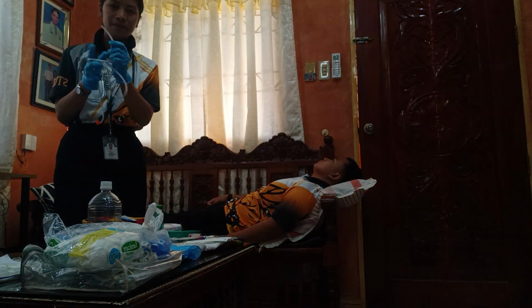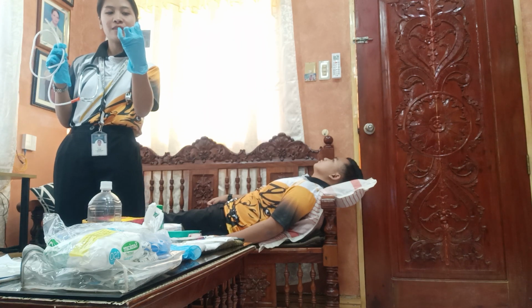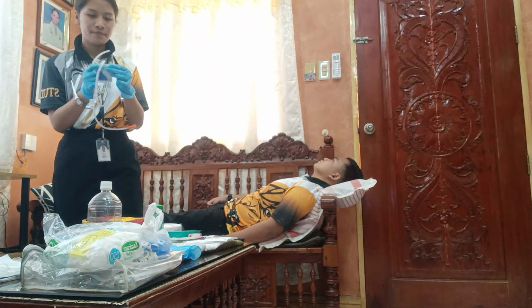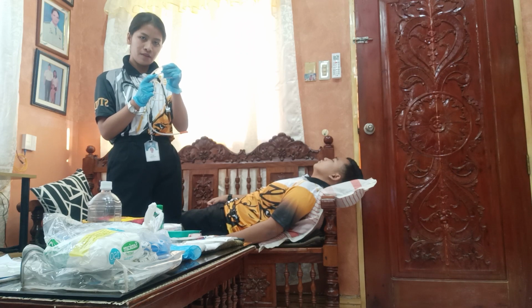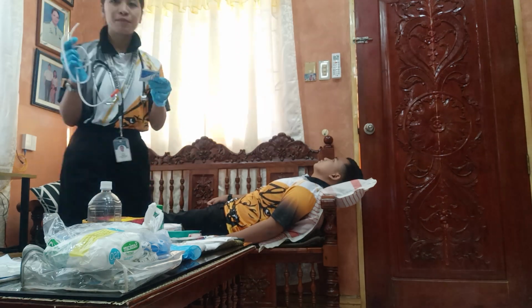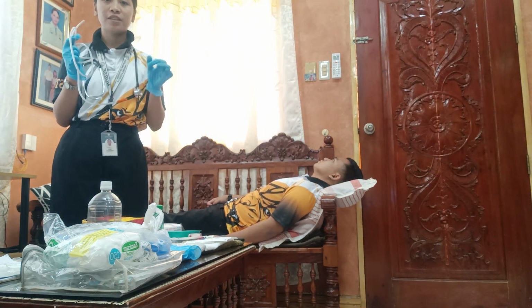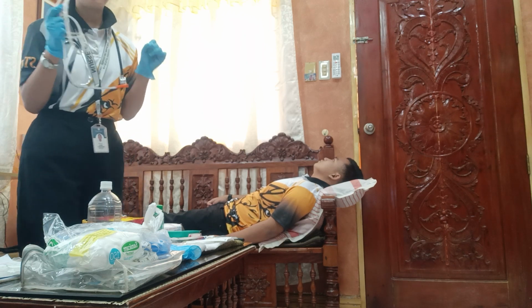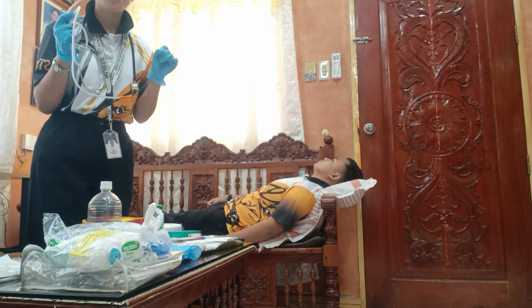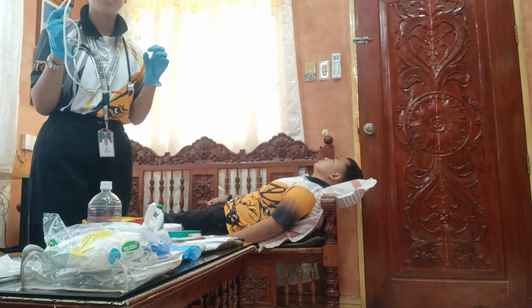Ito po yung tip po ng tube, tapos ito po yung gamit natin. Personal lubricant, water-based. For the rationale of this po, lubrication reduces the friction and facilitates the passage of the tube into the stomach. Water-soluble lubricant po will not cause pneumonia.